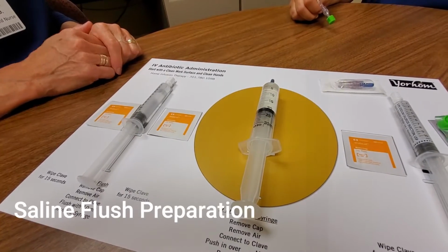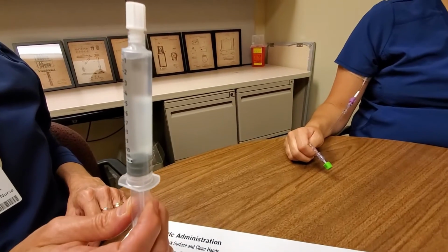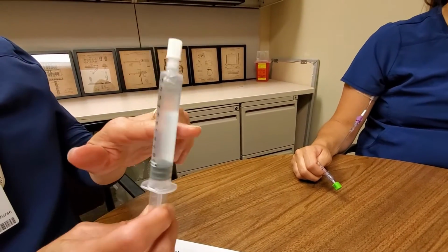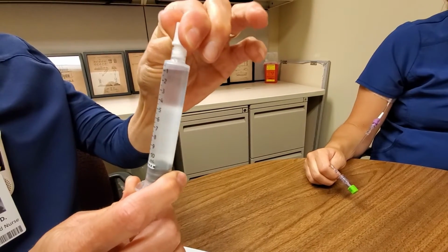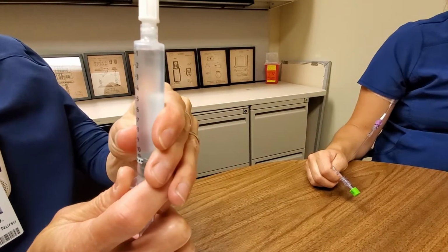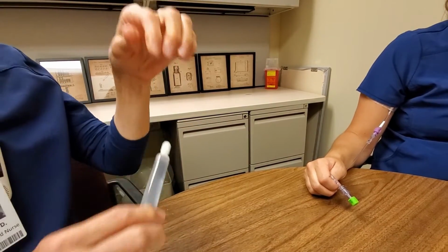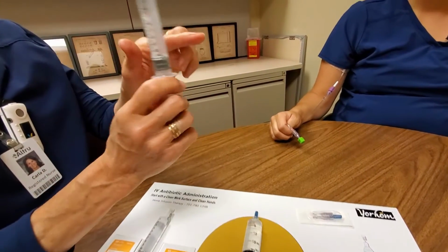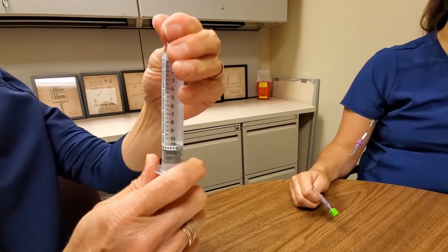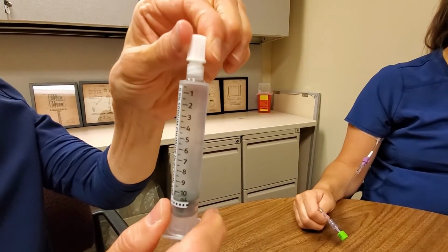Prepare your saline syringes by removing any air. Start by holding the saline syringe with the tip pointing up. Tap on the syringe barrel to move the bubbles to the top of the syringe. Next, loosen the white cap with a half turn and firmly press on the plunger until you see a drop of fluid. Retighten the cap before placing it back down. Do this with both saline syringes. If you touch anything else other than your supplies, you should wash your hands again or use an alcohol-based hand sanitizer.